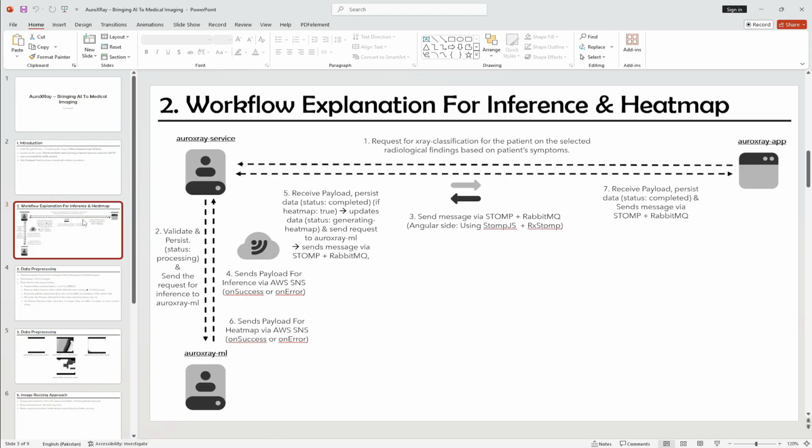We are using DenseNet121 as a pre-trained transfer learning model for extracting the features. Then it transforms them into a Mulan computable instance because I'm using the binary relevance algorithm. And then finally it performs the classification based on the selected radiological findings.